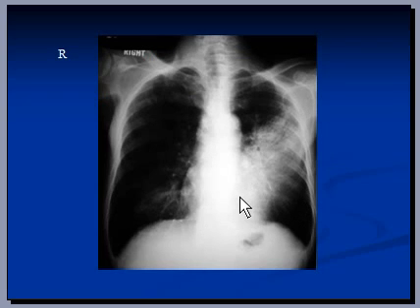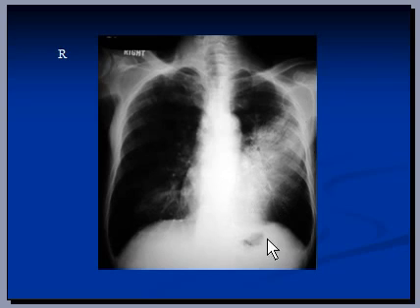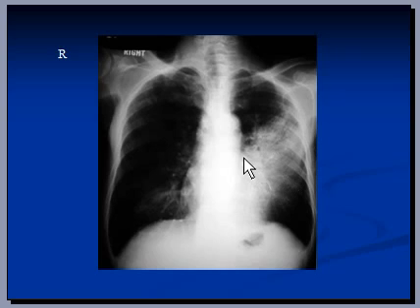Another chest X-ray shows consolidation in the left lingular region. There is an area of the left lung which is known as the lingula, and this X-ray shows consolidation in the left lingular region. Notice you cannot see the left cardiac border here — the left heart border is not visible.